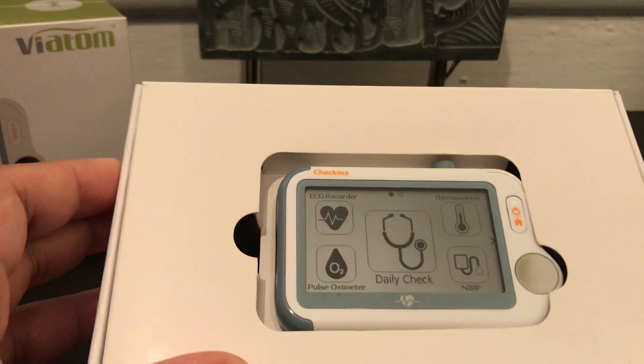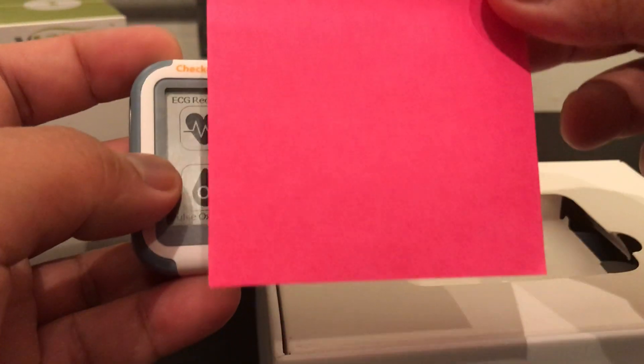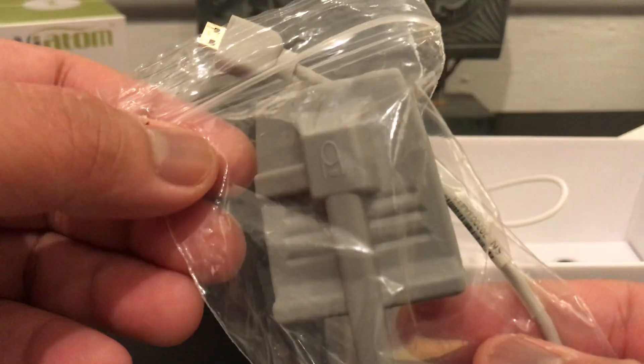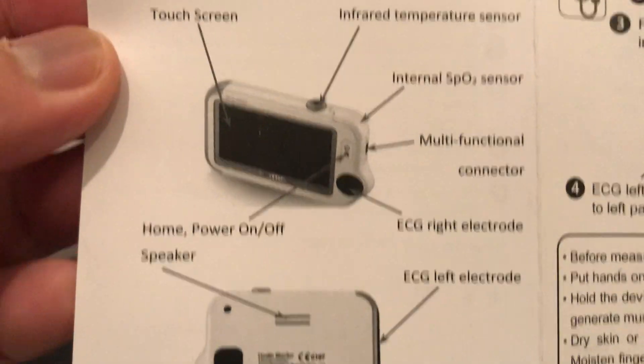When you open the box, you'll get to see this innovative medical device that is as small as — even smaller than — a Post-it. You'll get a silicone case, a wrist belt, two leads, an ECG cable, an oxygen sensor, a USB cable, the manual, ten pieces of ECG pads, and a quick reference guide on how to use the device without going through the extensive manual.